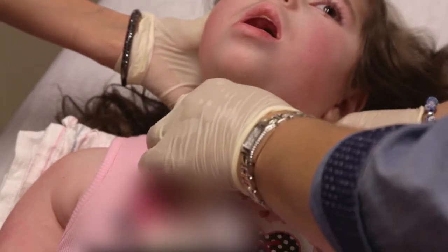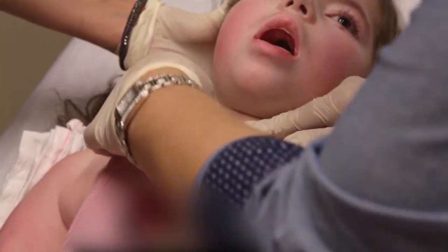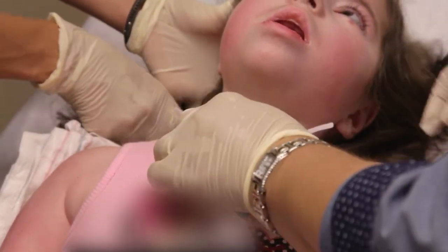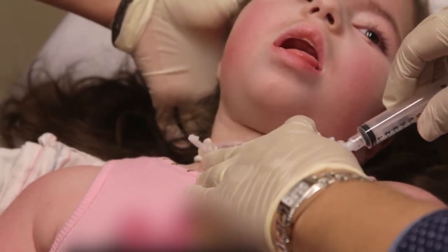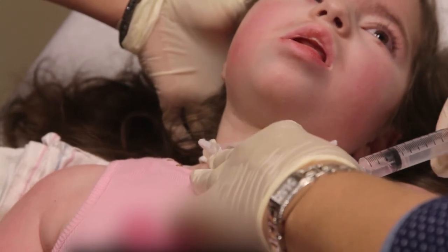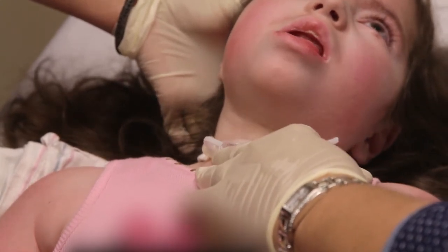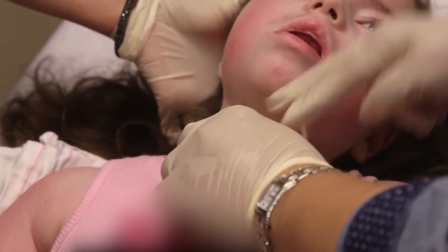I'm going to remove the Velcro ties because I'm the assistant here. When we do an elective trach change, we have 2 people, Drew, don't we? We want 2 people, mommy and somebody else, or daddy and somebody else. I'm going to secure the tube in place. I'm going to remove the water that's in the cuff right now, and you're going to get louder. Okay, and I'm going to wait for April's signal to remove the tracheostomy tube.